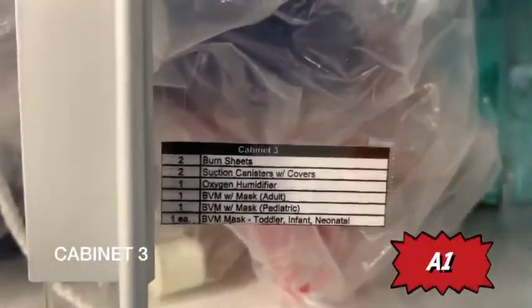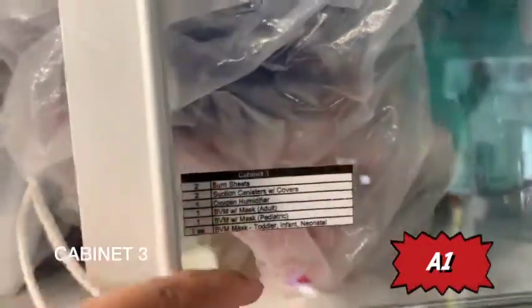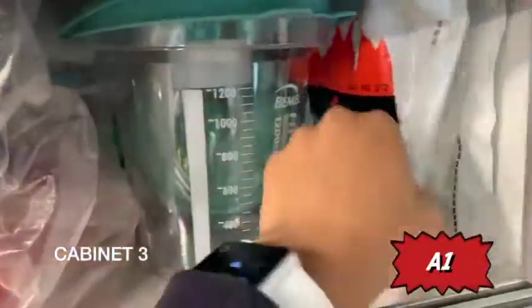Moving on to cabinet three. You'll have your burn sheets, suction canisters, oxygen humidifier, and all types of BVM. In addition, you'll have two CPAP masks — that's Continuous Positive Airway Pressure — with tubing and mask. Also, suction canisters, burn sheets, and all your types of BVM.